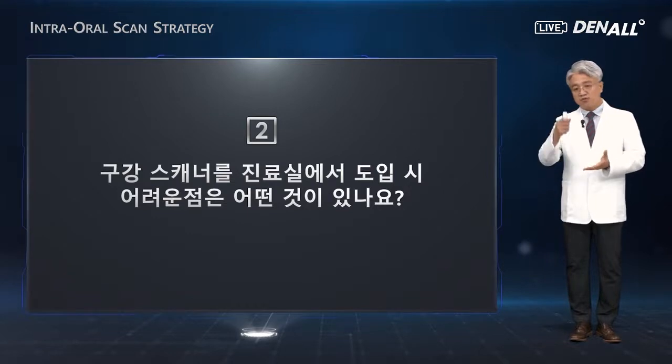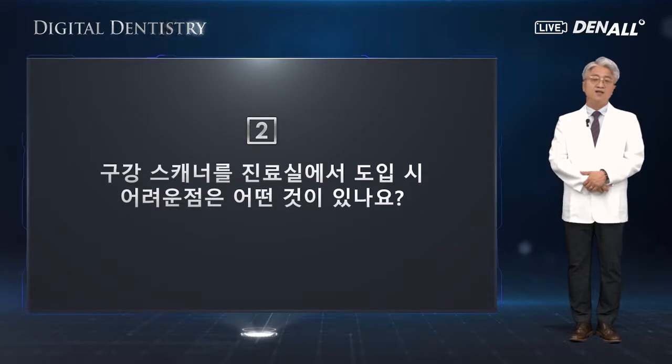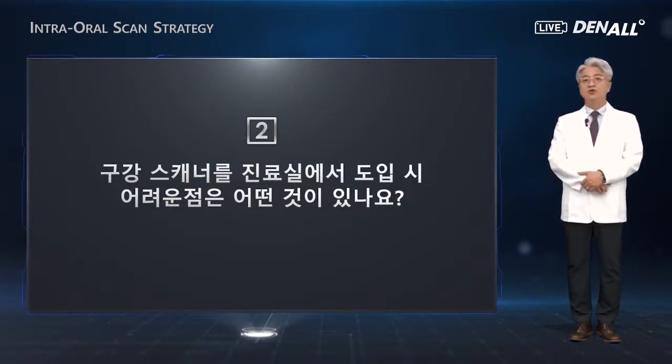Conventionally, precise impression taking was possible through training. Now, a new impression technique is adopted using the oral scanner. Therefore, the staff may resist the adoption of new technology. So it may take some learning curve before they get used to it, and that may be the biggest barrier.